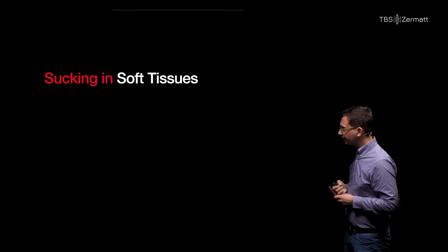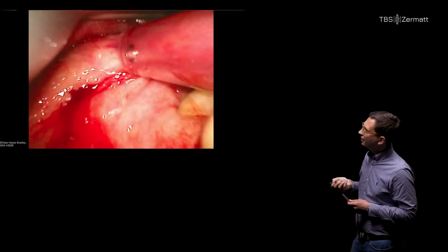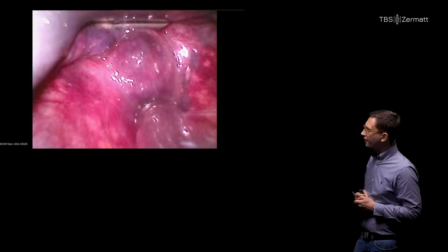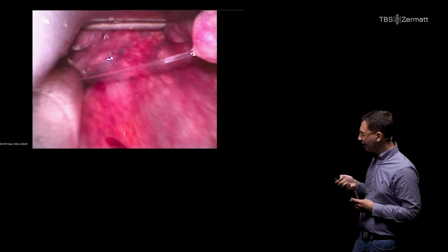The next pitfall, often not discussed, is suctioning soft tissues. In this intubation example, the catheter is actually suctioning the uvula, which can cause trauma. In another intubation shown here, the suction catheter is stuck on soft tissue and causes a hematoma. This may be concerning on a second look when you see hematoma in the airway — just keep in mind that this can happen.